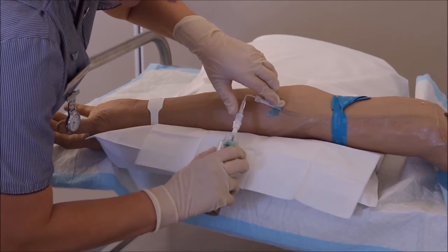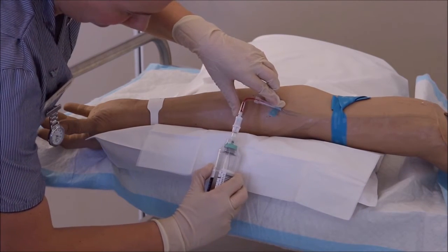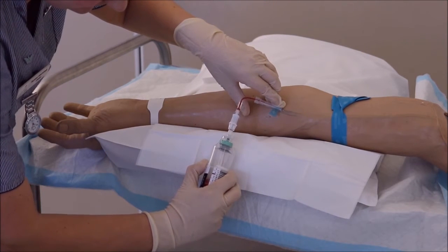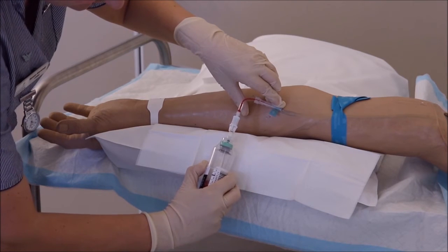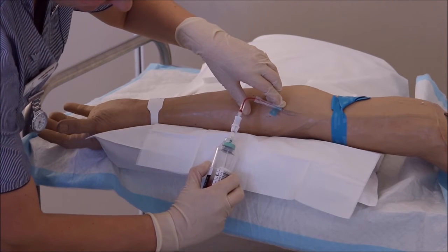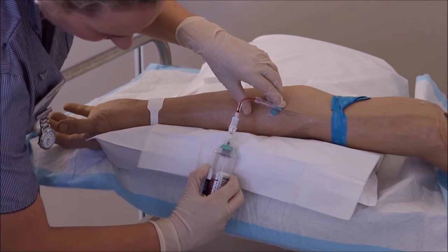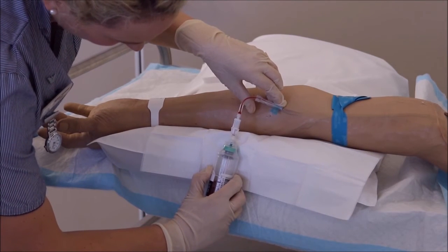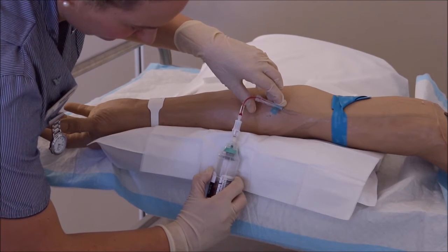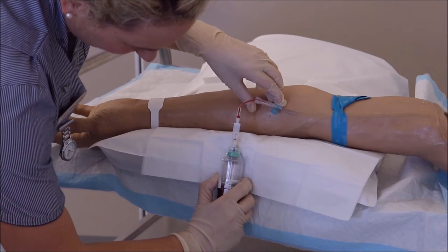Using the aerobic bottle first, green top, hold bottle upright below the level of the arm and connect the adapter cap. Pierce the septum to fill with 10 milliliters of blood. The more blood, the better chance there is of identifying the causative organisms. Smaller volumes, such as less than 5 milliliters, significantly reduce the chance of bacterial growth. 4 milliliters of blood is required for pediatric blood culture bottles. Repeat the process with the anaerobic bottle, orange-topped bottle. Use monovet collection tubes if further bloods are required.